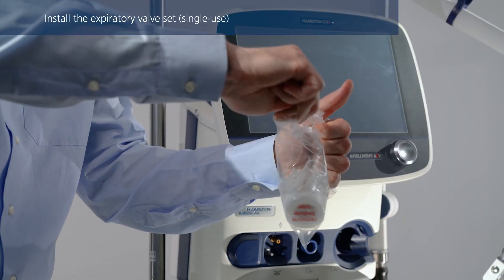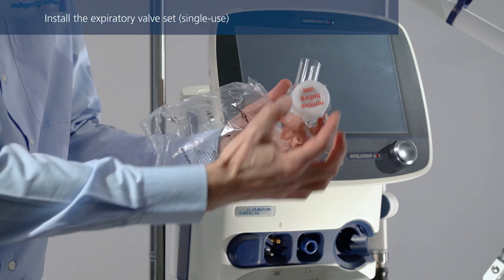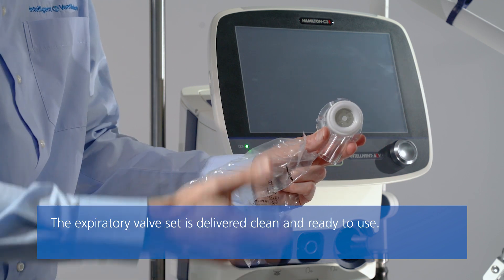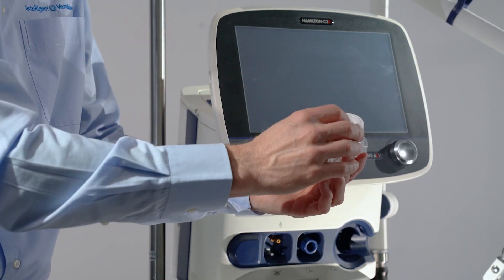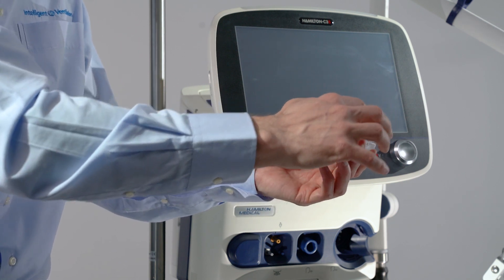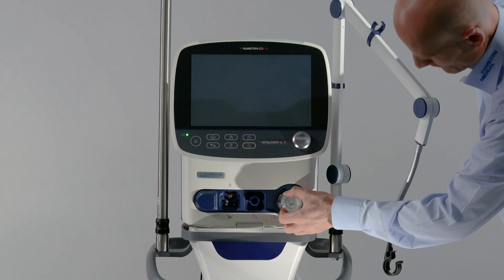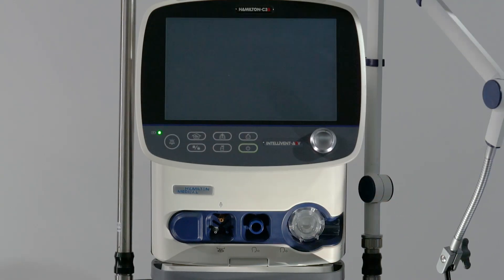If you are using a single-use expiratory valve set, first remove the safety cover. Ensure that the membrane is properly aligned with the expiratory valve housing and the metal plate is facing upwards and is visible. Position the valve in the expiratory port, ensuring it is straight, and twist it clockwise until it locks into place.